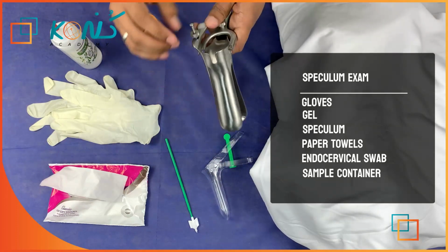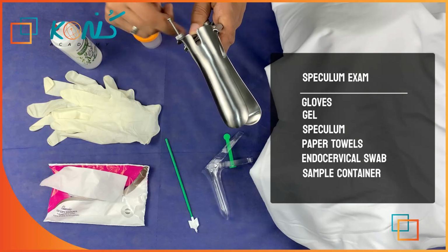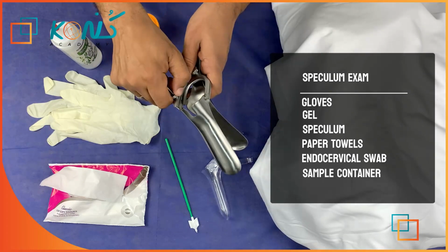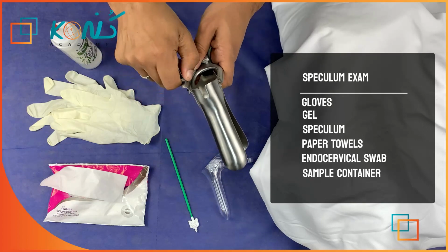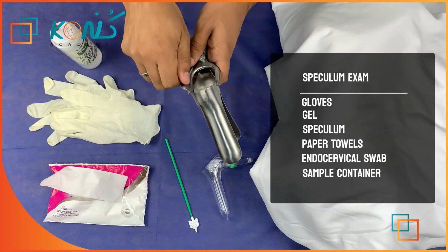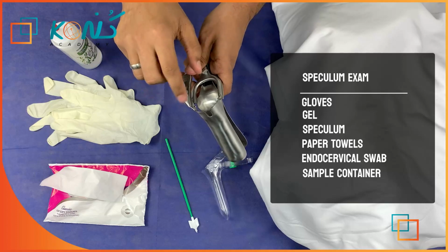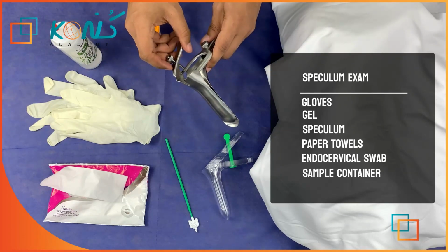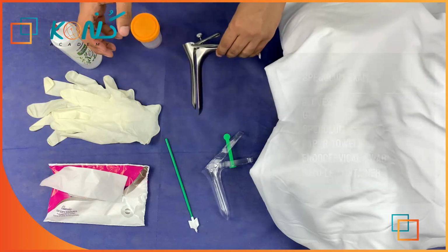And take care about these screws that we are using to lock. These screws, we rotate them clockwise like this to lock the speculum, and we open them anti-clockwise to close it again. All right?